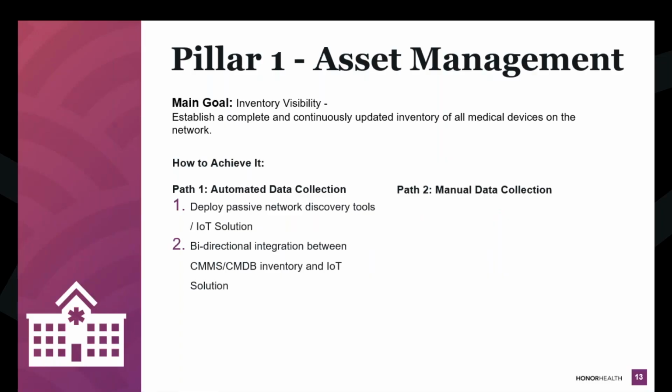So deploy that IoT solution, set up that bidirectional integration between your CMMS or CMDB with your IoT solution. What that means, what Lynn touched on earlier, is if my technician updates the CMMS, that information feeds into my IoT solution, and vice versa. If that equipment moves and it's now no longer on the 4th floor, but it's, I don't know, on the 2nd floor, it updates in your inventory system. So the next time the technician looks at the inventory, oh, okay, the equipment is on the 2nd floor. Now, for us, it updates every 24 hours. So I understand infusion pumps move around between then, but at least you have a good starting point to locate that equipment.